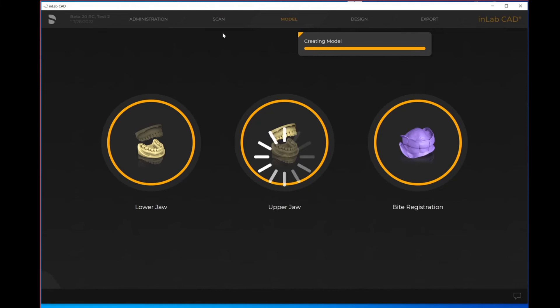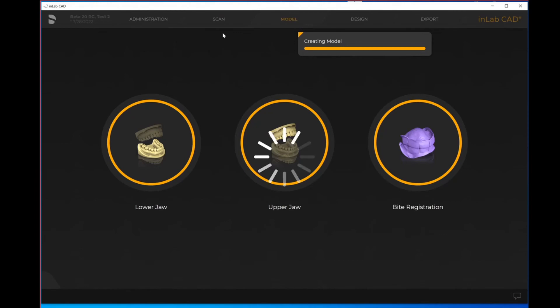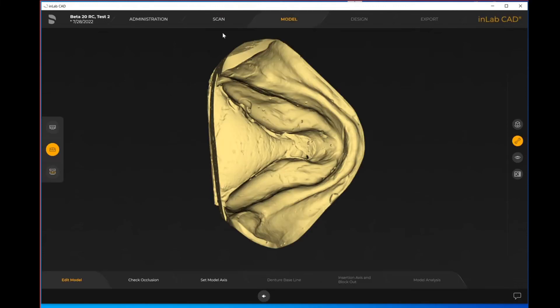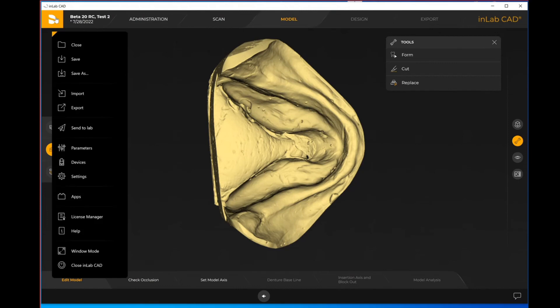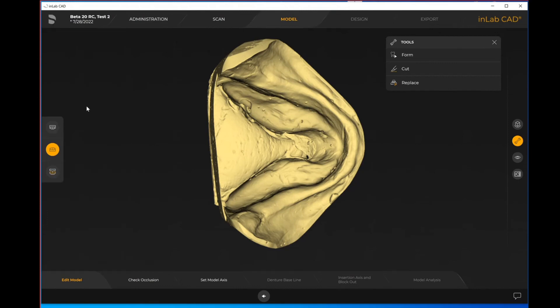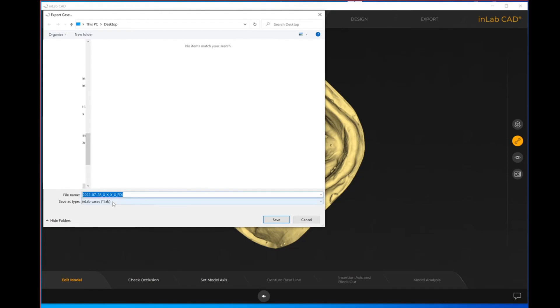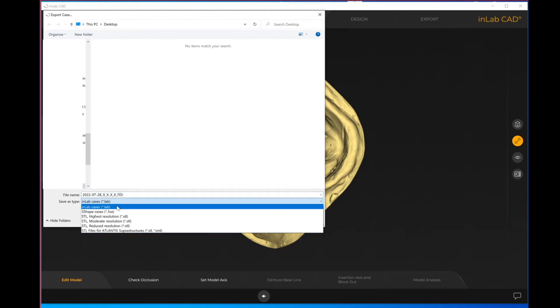In this video we've covered how you can import STL files as well as how you can import other files like DXDs, 3Shape files, even dot inLab files from another inLab user. We also showcased in the scan step that is the only spot that you are able to import your STLs. Once I'm in the model step I can hit this Dentsply Sirona logo and you'll see that export becomes available.